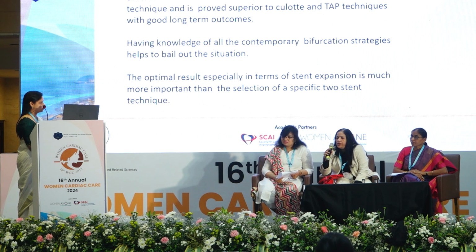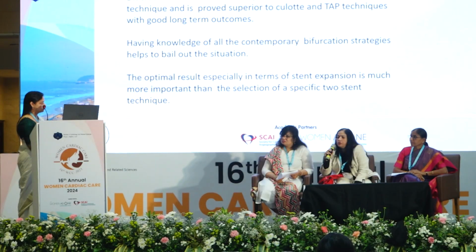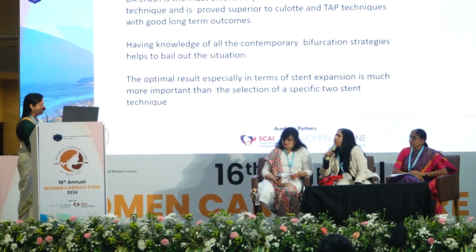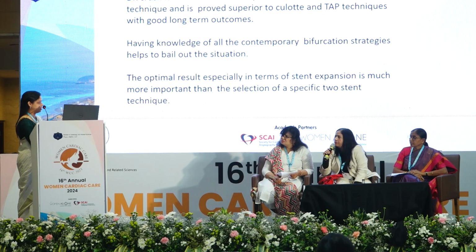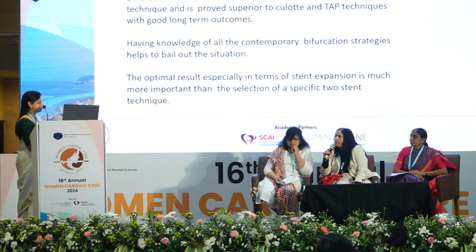Number two, your mid-LAD lesion was either an extreme spasm or query dissection. Ideally, it could have been sorted by imaging. But you said it could be an intramural hematoma. Yes. Intramural hematoma will worsen if you put more stents. Ideally, intramural hematoma should be again cut. Use a cutting balloon, drain it. Yes, right. And your hematoma gets dissolved. But eventually you managed to get it better with a stent, so it looks more like probably an edge dissection.